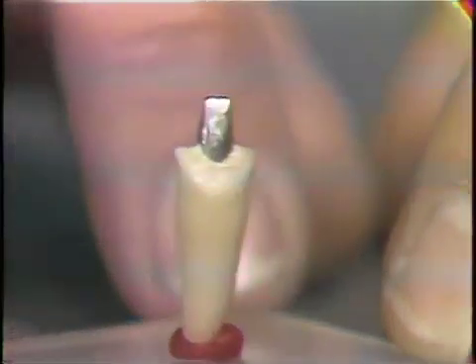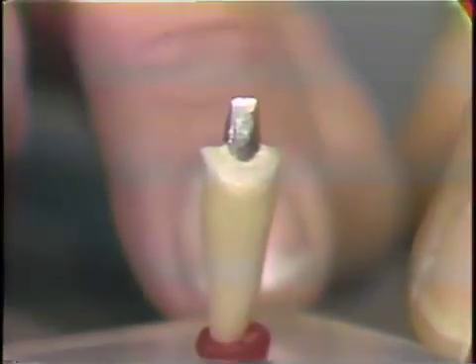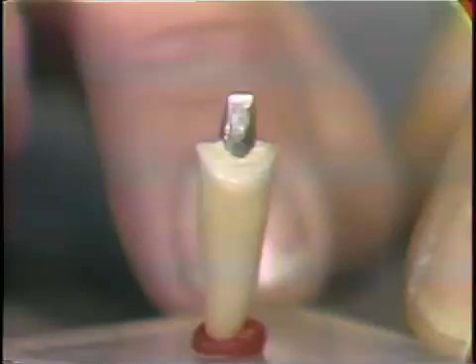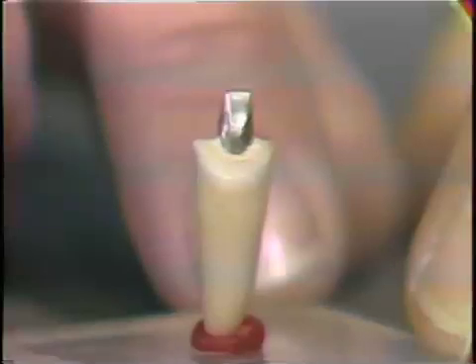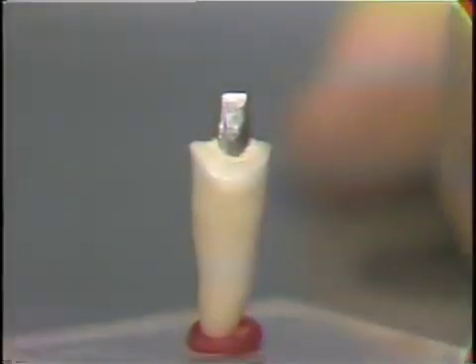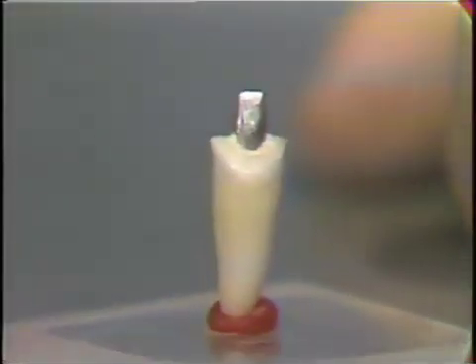You'll notice that the shoulders here are a little wider than they are in the preparation on a vital tooth. We're not concerned here with the pulp, so we can have wider shoulders and give ourselves a little more working room in the final preparation. I have another model on which I can demonstrate the actual post itself.